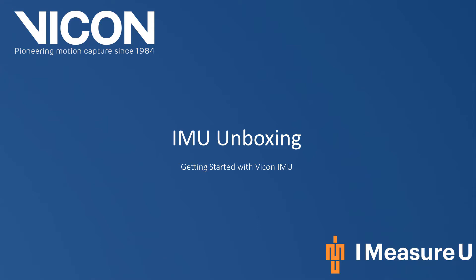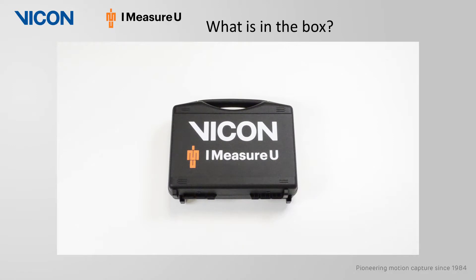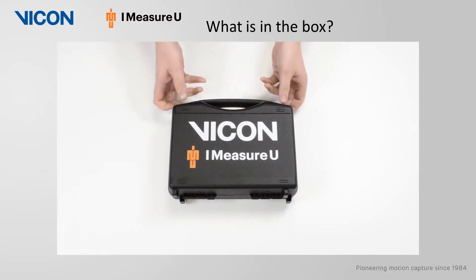Welcome to your Vicon YouTube tutorials. Today we will be unboxing the iMeasureU inertial sensors. All of your IMU devices and their associated accessories will be provided in a secure and compact handheld case.